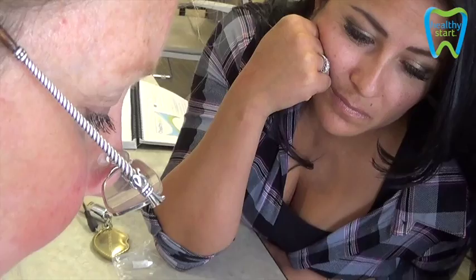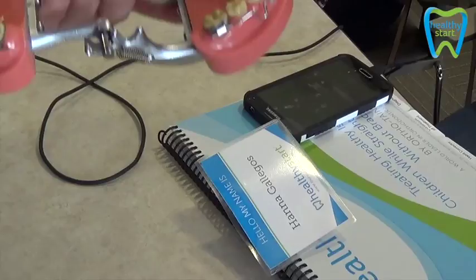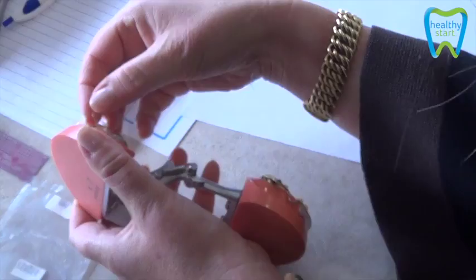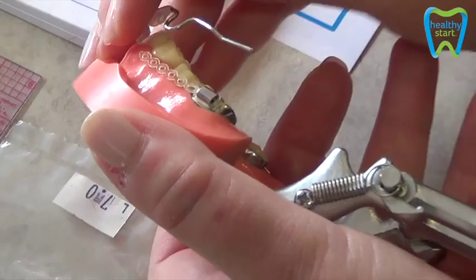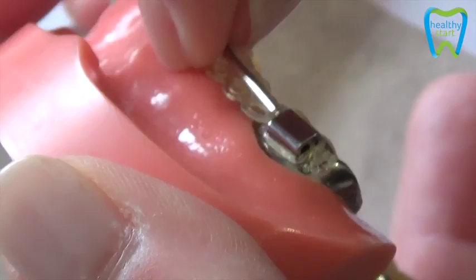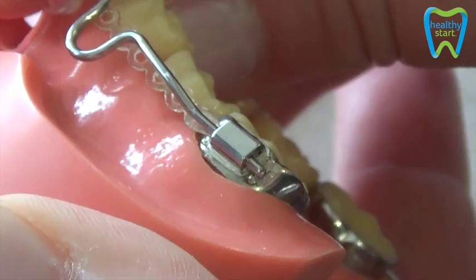This elastic has a circular kind of shape to it. Before we put the bumper in, we're going to put that loop around the tubular band. Then we take the bumper and put it into the tubular band. And then this elastic goes on this hook — it can go behind it or in front of it. It's just to anchor it, so it allows the front teeth to slide freely over the bumper.